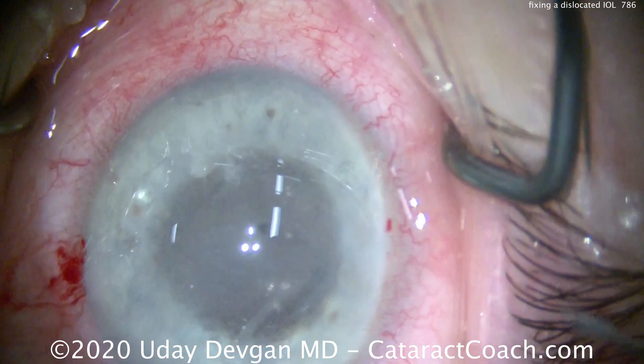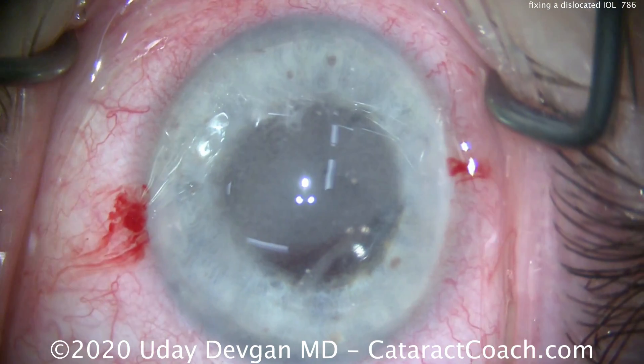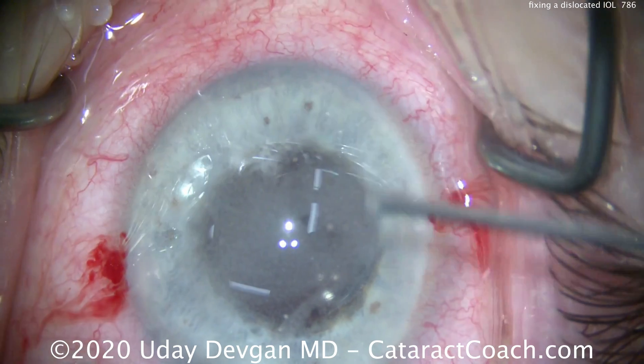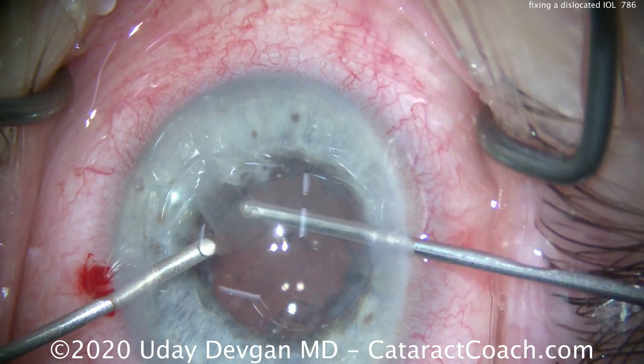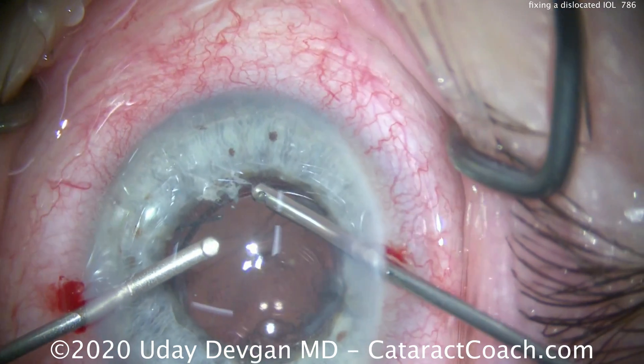We put some triamcinolone inside the anterior chamber because those particles will stain the vitreous. Now when we put the infusion in, we'll be able to see the exact area of the prolapsed vitreous. With the infusion in the left hand and the cutter on the right, we can see there's a significant degree of vitreous prolapse contributing to the lens shift and decentration.